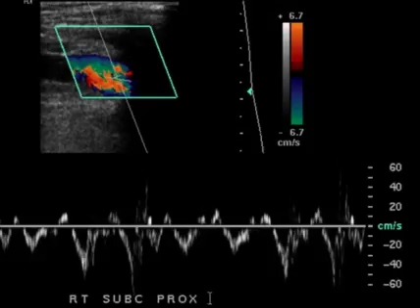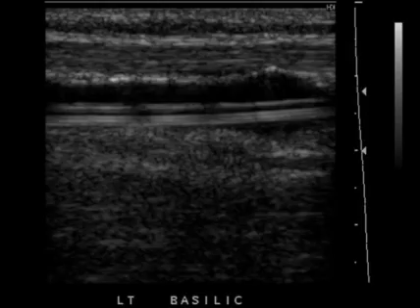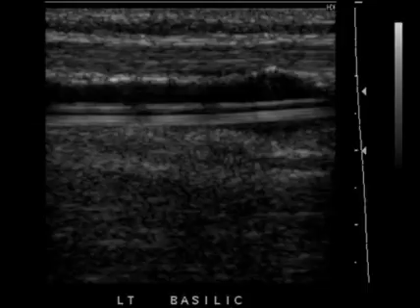Always very important in the upper extremity venous system to identify the normal venous pulsations. Remember, this is a typical systemic vein which is closely connected to the right atrium and therefore should have this very choppy kind of sawtooth triphasic pattern that is typical of most central systemic veins. We also may identify catheters in these veins. The cephalic vein or any of the veins in the upper arm may actually be used for venous access, particularly PICC lines and other long indwelling catheters.